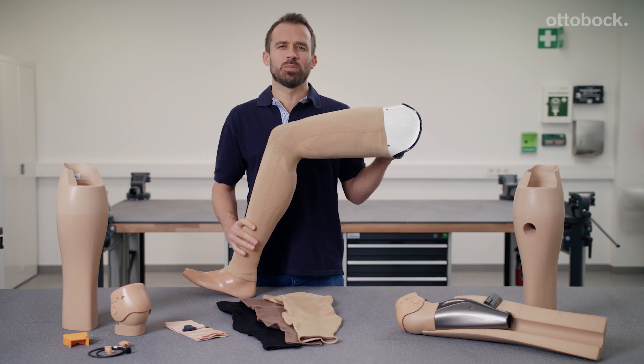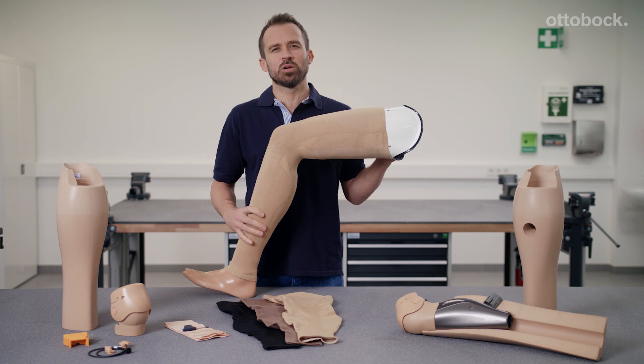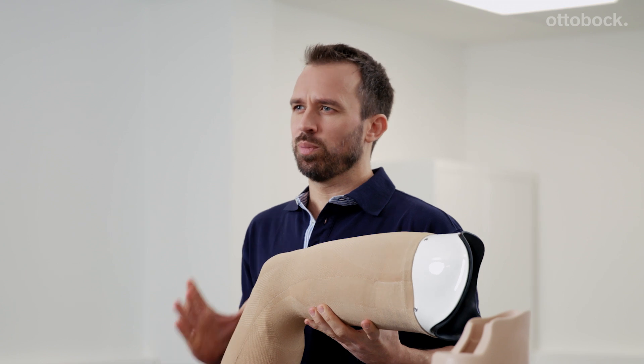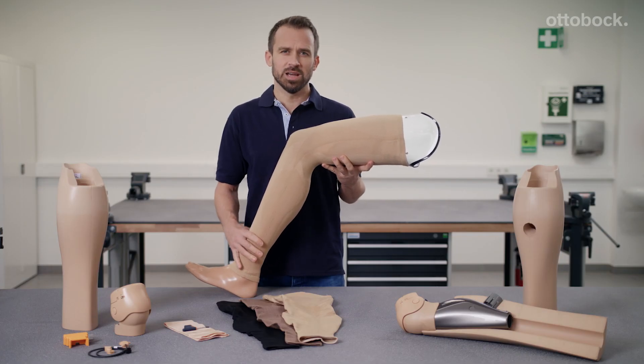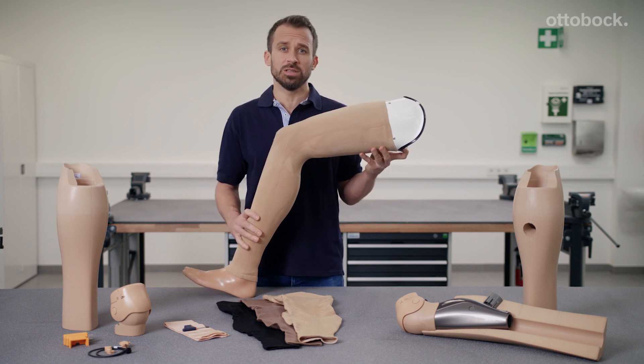Anyone who wears a prosthesis should be able to feel as if it is a fully adequate replacement for the actual leg. My customers often tell me that performance and personality are what counts at work and in their social lives, and that they prefer not to stand out and look different from their peers and colleagues.